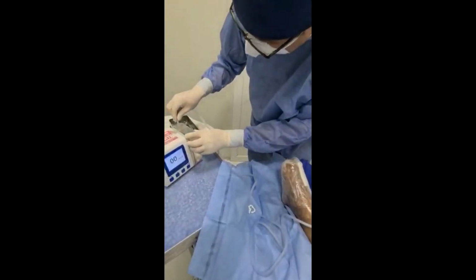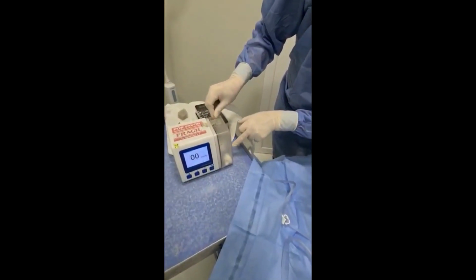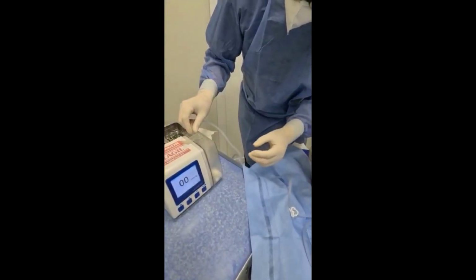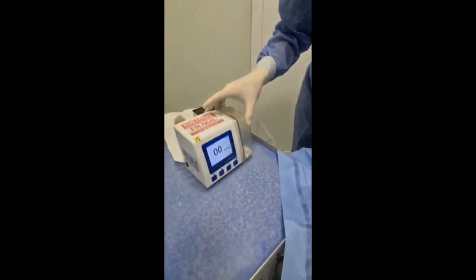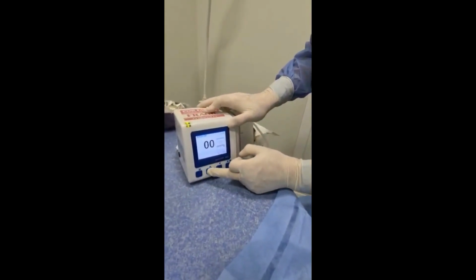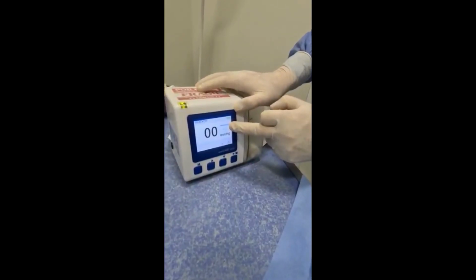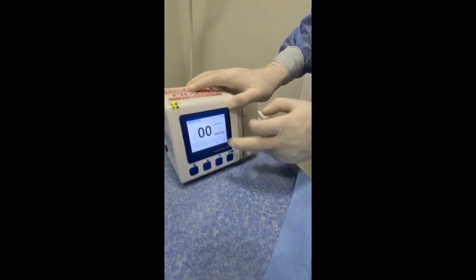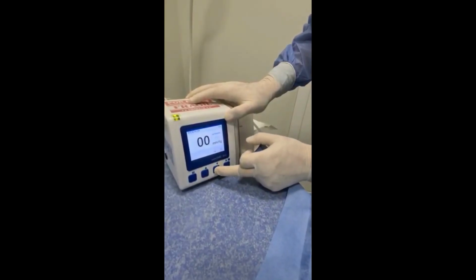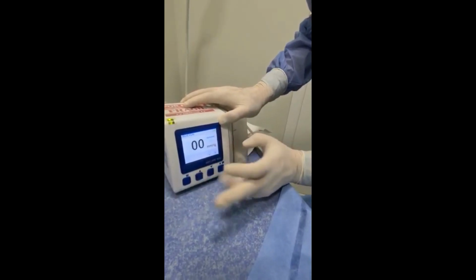Well, we make the connection in the canister, which would be the reservoir that has a gel where the secretion is going to fall and solidify. A kind of gel that has no smell is wrapped. So then we have here the pressure that we are going to maintain at 110 millimeters of mercury. The vacuum pressure that can go to the device is up to 120, depending on the characteristic of the wound. If we want, we lower a little bit or raise, we lower to 100, we maintain at 110.